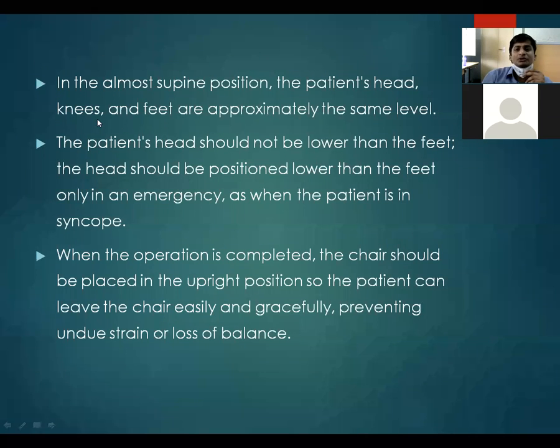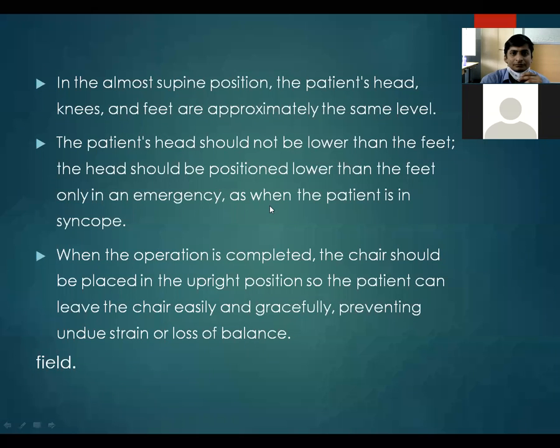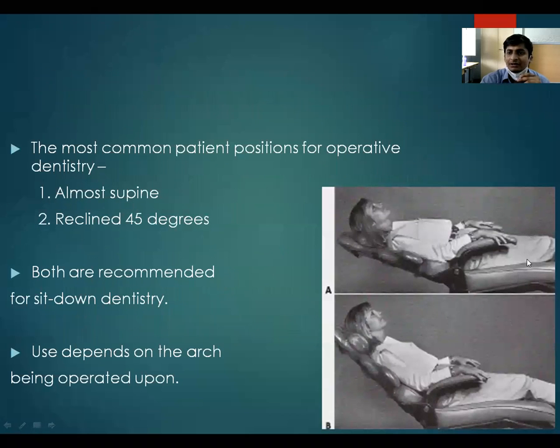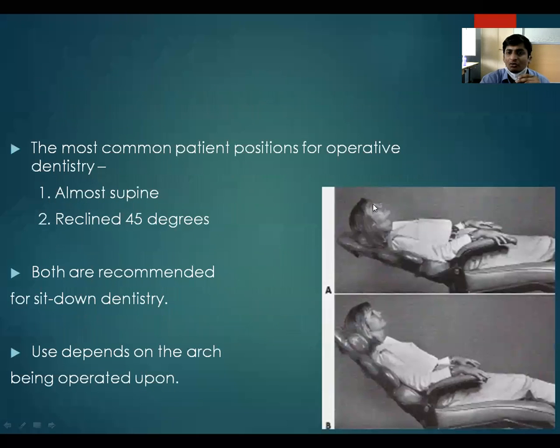In the almost supine position, the patient's head, knees and feet are approximately at the same level. Here you can see, in almost supine position, the patient's head, knees and feet are at the same level. The patient's head should not be lower than the feet. The patient's head should never be lower than the patient's feet. The head should be at the level of or above the level of the feet.